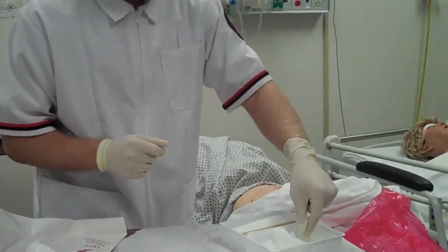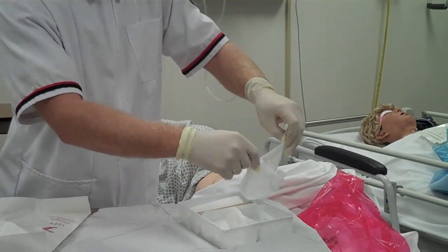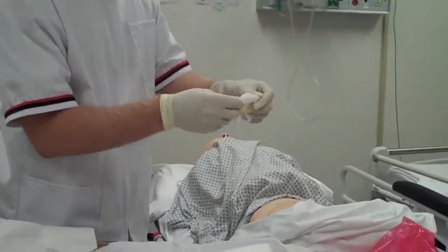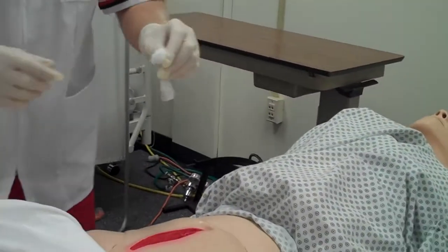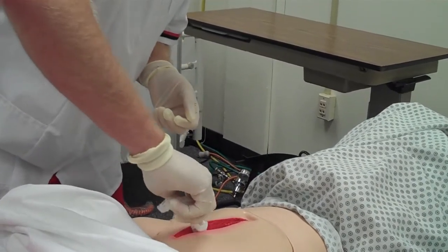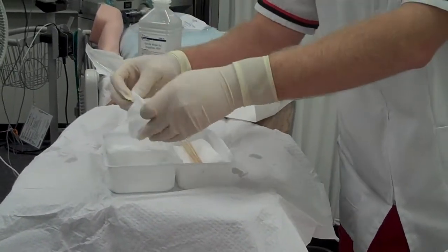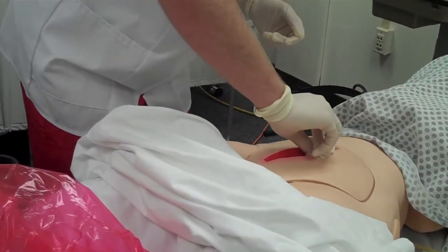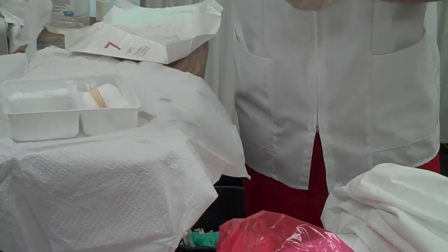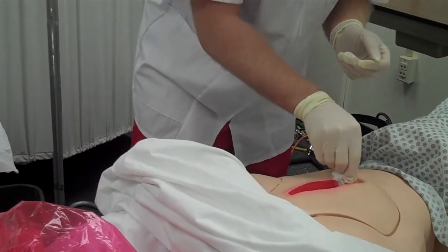What I'll do first is with my wet gauze right here, going to clean the inside of the wound first. Put that in my red bag. Then I'm going to clean the outer edge. Dispose of that in my red bag. Then I'm going to clean the edge toward me. Dispose of that.